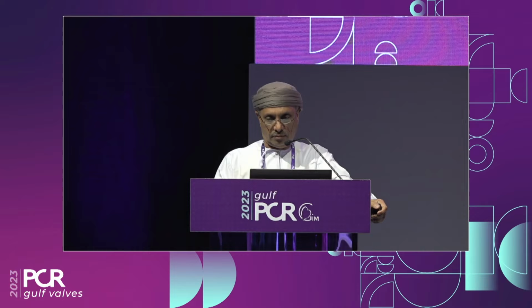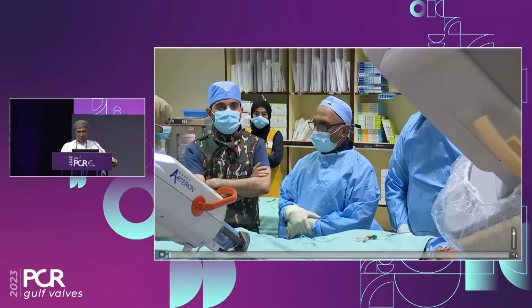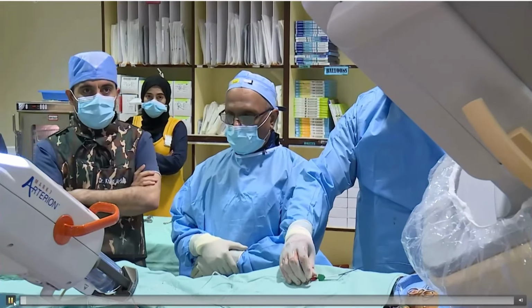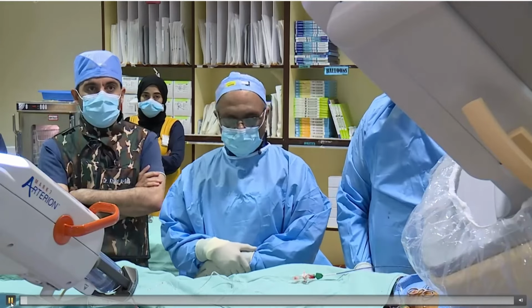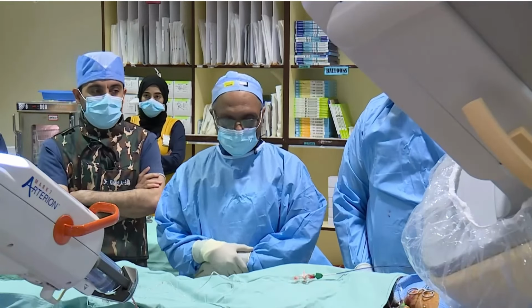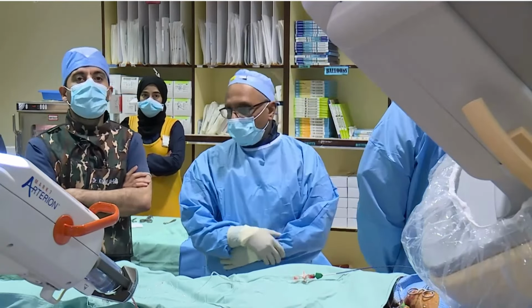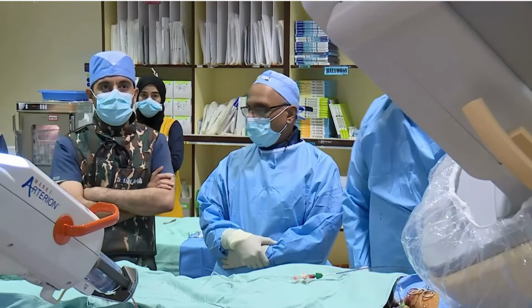Hello, everybody. My name is Mohammed Mukhaini, interventional cardiologist from the National Heart Center. We are presenting an interesting, challenging TAVI case using a Navitor system. Before we start presenting the case, I'll introduce you to the team with me, Dr. Mohammed Barakat Riyami, Dr. Khalid Al-Saidi. Now, Dr. Khalid will introduce the case.